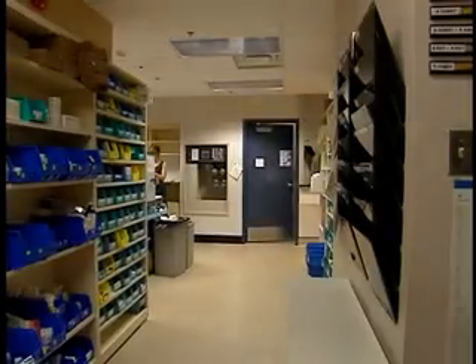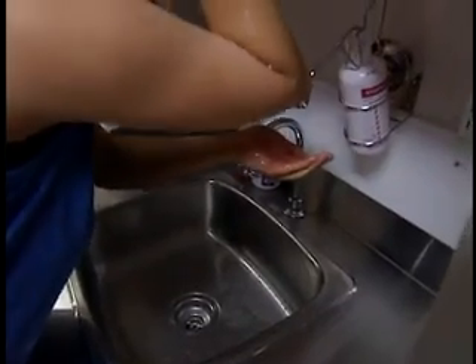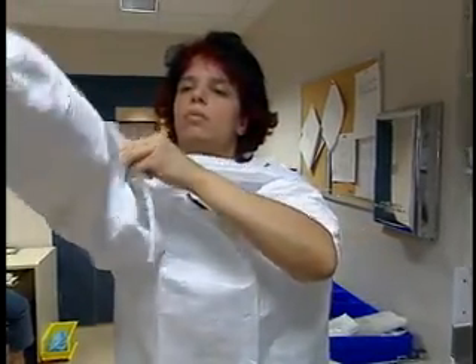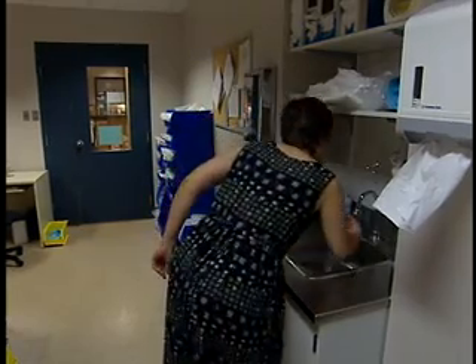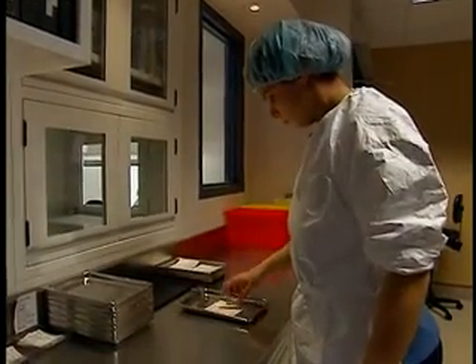Now let's look at how to prepare for aseptic manipulation. First, remove any jewelry and tie back your hair. Remove your lab coat. Put on shoe covers when you enter the anteroom. Perform antiseptic washing. Put on a clean gown and pull the sleeves up above your elbows. Put on a cap and, if necessary, a beard cover. If you do not have to enter the aseptic preparation area, you must still put on shoe covers and perform aseptic washing when you enter the anteroom, but you do not have to put on the rest of the protective garments. In the anteroom, take out the supplies and products you need for the preparation and place them on a clean tray.